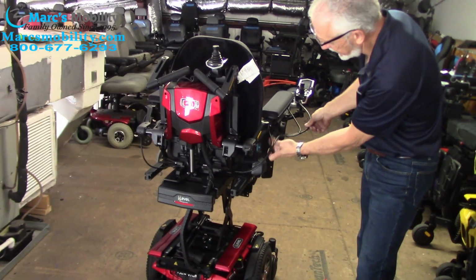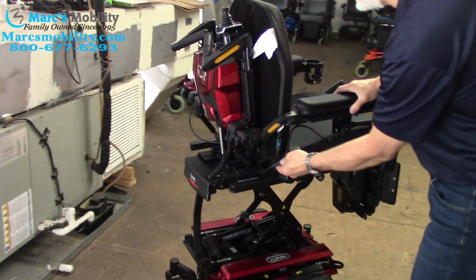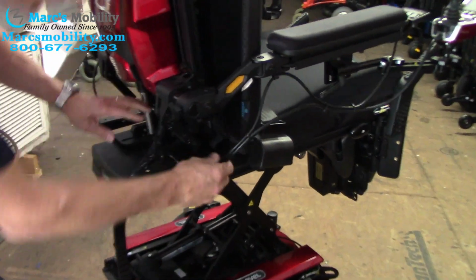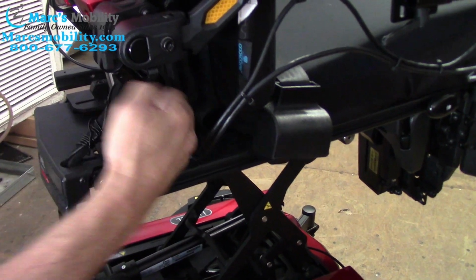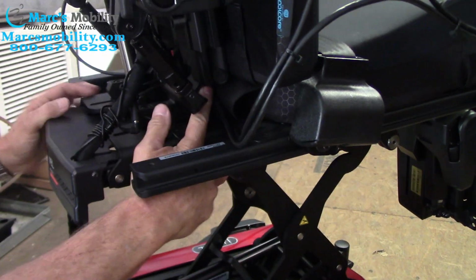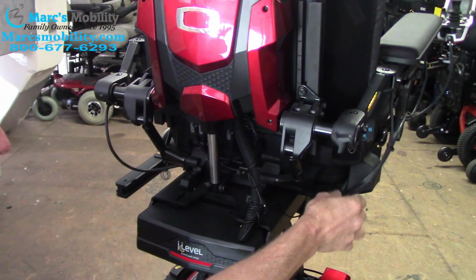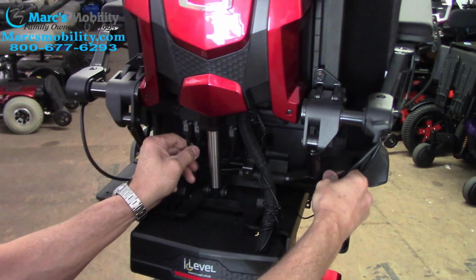So you follow the cable on your chair, and I looked it up the other day on the computer, it goes through. You can see it goes through this little triangular bar inside of here where my finger is. Right there. It goes through there, and it comes out. It goes through the back, and it hooks up right here. So if I pull the joystick cable, I can tell it's this one right here.